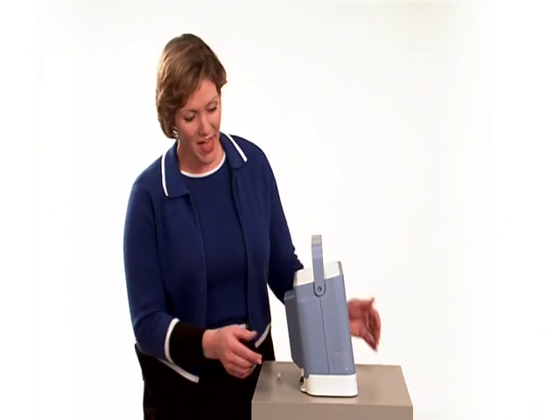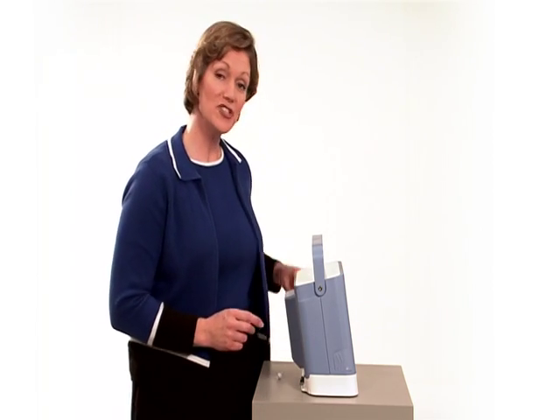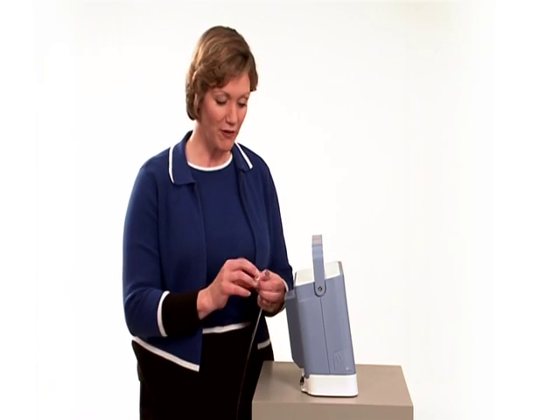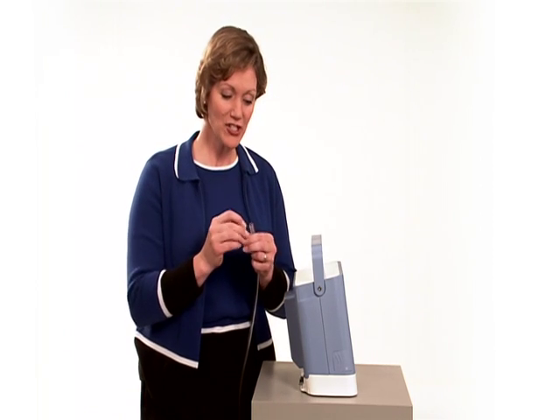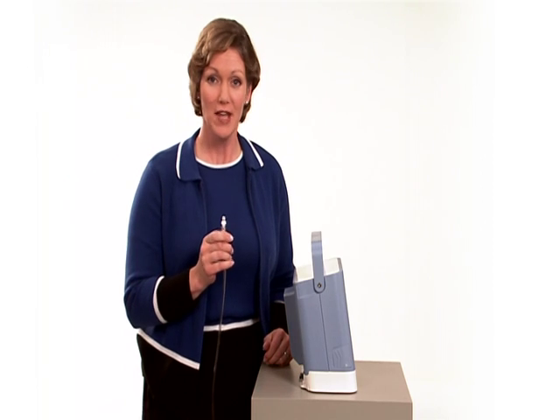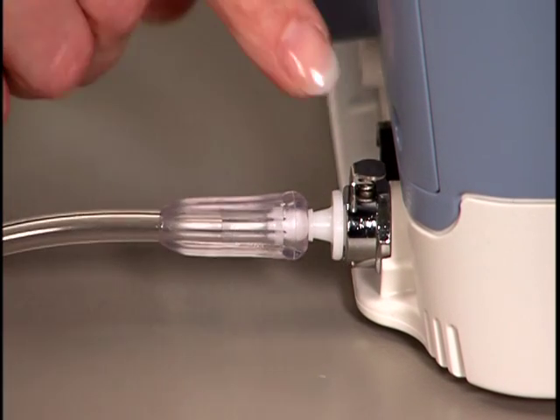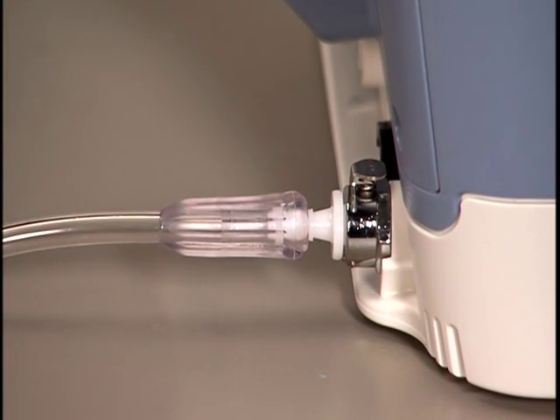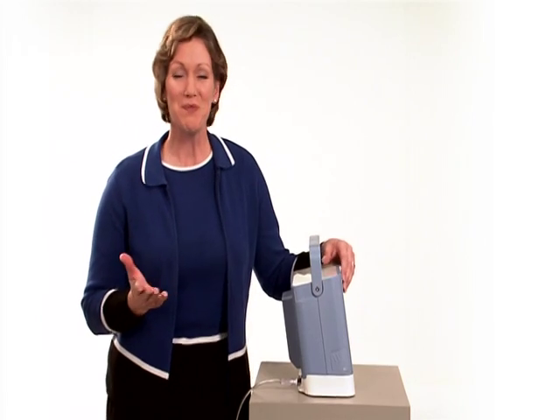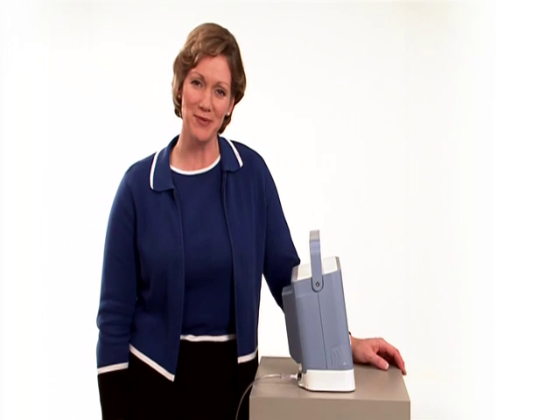If the physician has prescribed supplemental oxygen, that port is here on the back of the device. Connect the oxygen tubing to an oxygen valve quick connect. Attach the quick connect to the oxygen valve inlet on the back of the ventilator. Make sure you press the oxygen valve quick connect firmly into the inlet. You should hear a click and see the tab at the top of the port pop up. Once Trilogy100 is set up, you're ready to turn it on and interact with the screens.